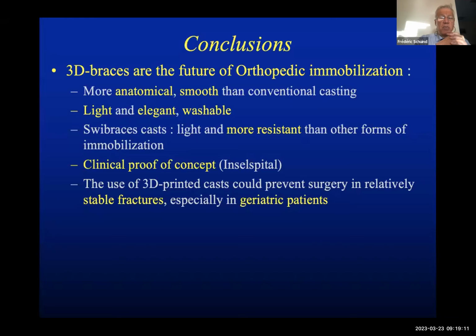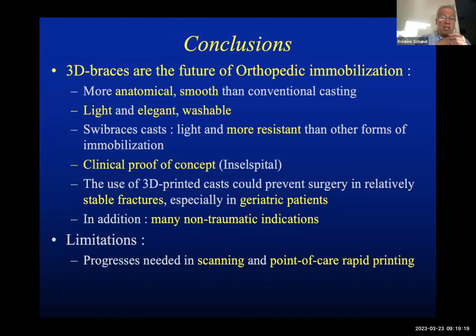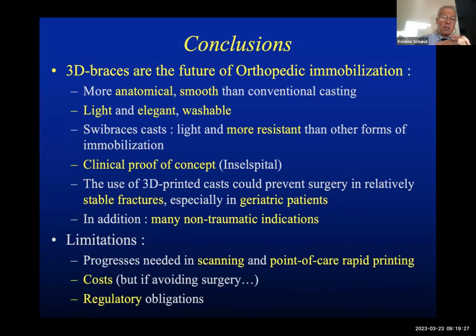In addition, there are many non-traumatic indications. But of course, there are a lot of limitations. We need better scanning and point-of-care rapid printing. Then there is the cost, but if we avoid the surgery, the costs are bearable. And in Europe there are regulatory obligations, maybe also in the US, I don't know exactly.